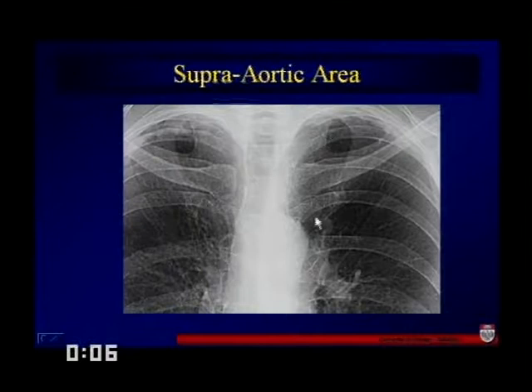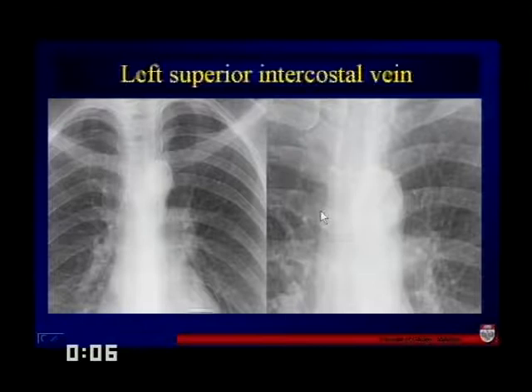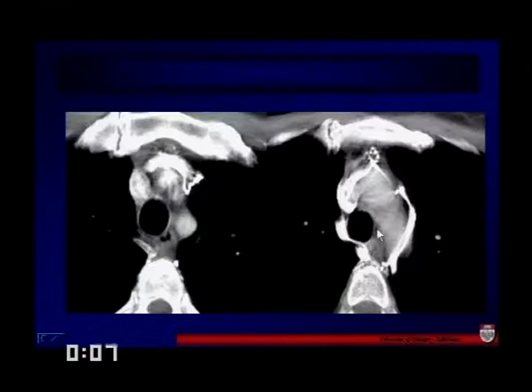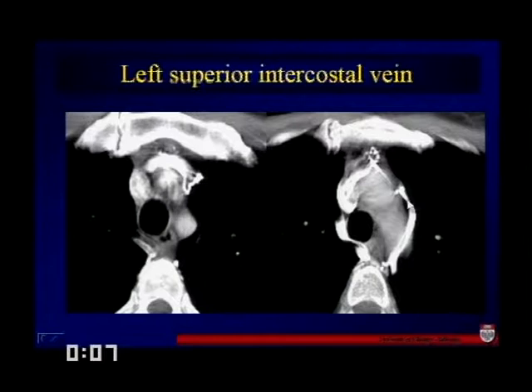This case shows an aortic nipple, which is formed by the left superior intercostal vein where it crosses over the arch of the aorta and comes superiorly downward across in front of it. You can see two different presentations of an aortic nipple, not to be mistaken for any kind of adenopathy. This is what it looks like by CT — the left superior intercostal vein crossing in front of the aorta forming our aortic nipple.